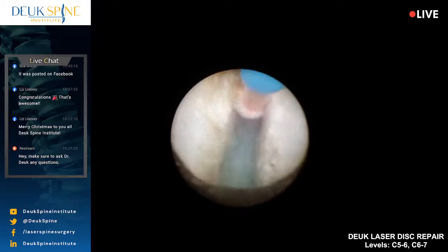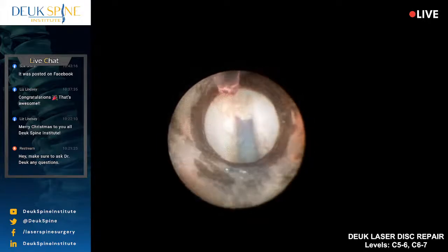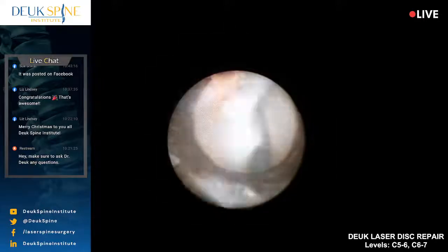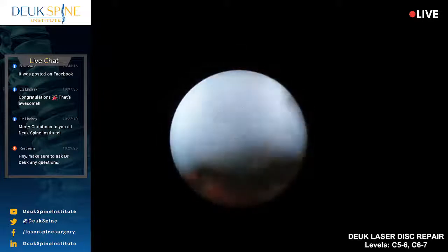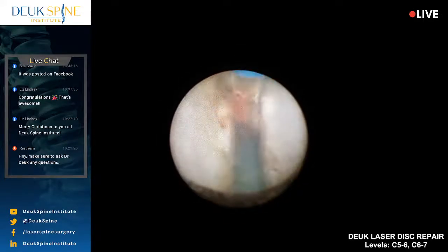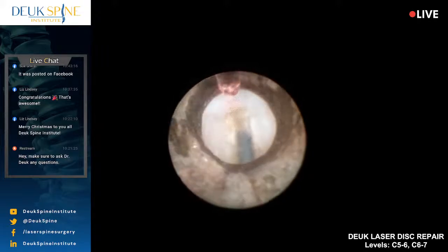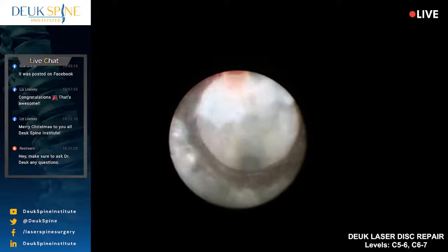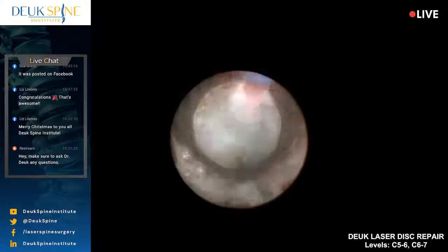Things are starting to look good. We're just about done. I think 5 more minutes. You see how this thing is so hard to get out right here? That's because it's calcified and scarred up. There's still stuff in that foramen I'm going to have to get out. All right, so I need to get a little more lateral into the foramen. Any questions from our audience?